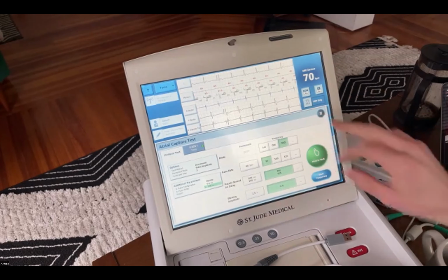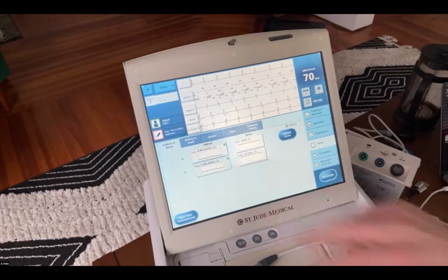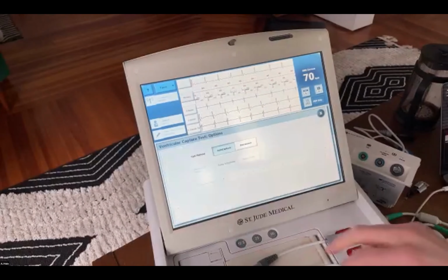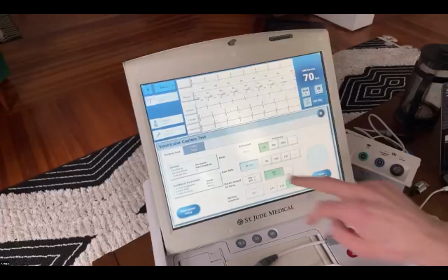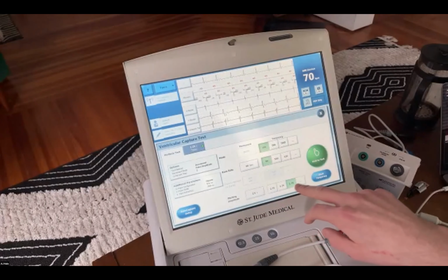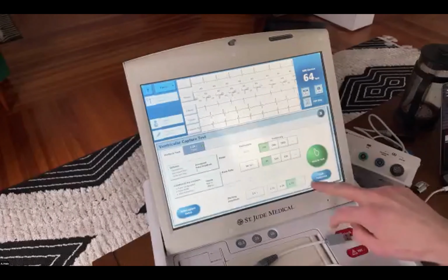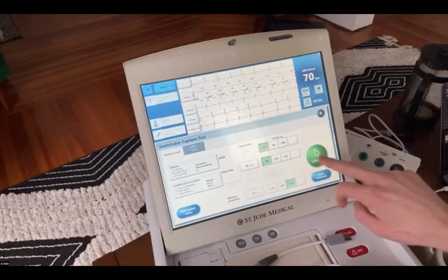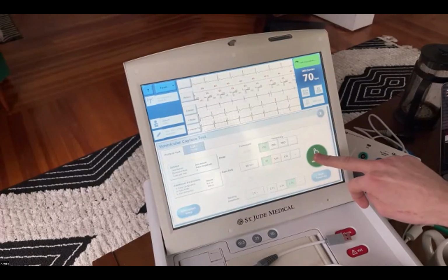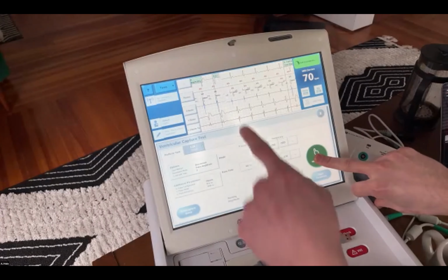If it's a dependent patient, I recommend starting at higher outputs or being ready to stop the threshold test right away, just so they don't have to go without pacing. Really quick, I'll go ahead and show you one. I'll see if it actually runs. I don't think it will, but for this ventricular capture test, for example, I'll go VVI 90 and our starting amplitude will be 1.75, which is above the 1.25. I'll hold the test. If this was a real event, it would actually go VVI.